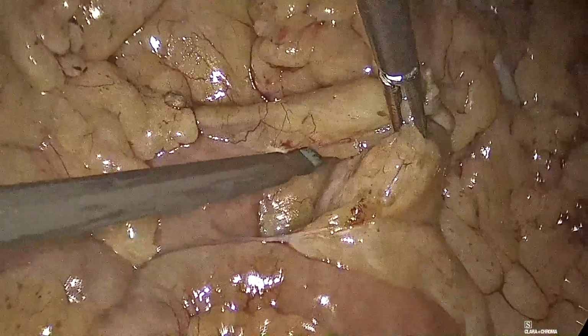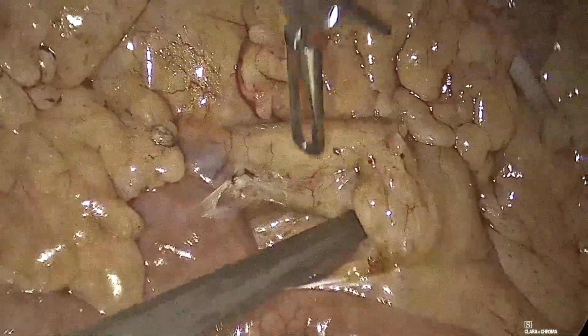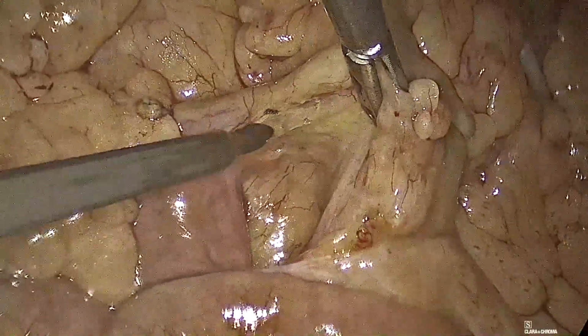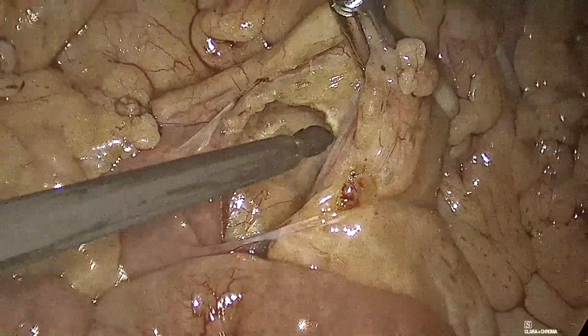Diagnostic laparoscopy was initiated with careful checking for metastatic deposits in the liver and the peritoneum and identifying the sites for port placement. Transverse colon and small bowel were displaced superiorly and medially, respectively, to identify the IMV. Dissection was then started under the IMV to initiate the medial to lateral approach, displacing the Toldt's fascia down.